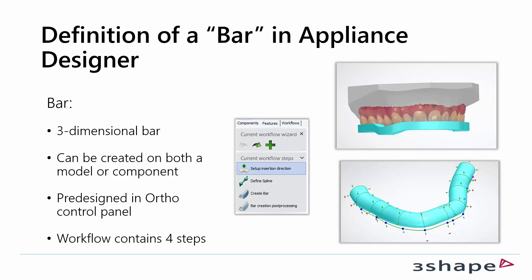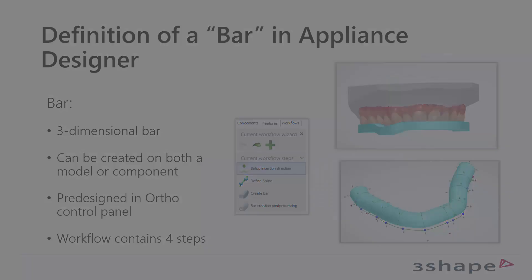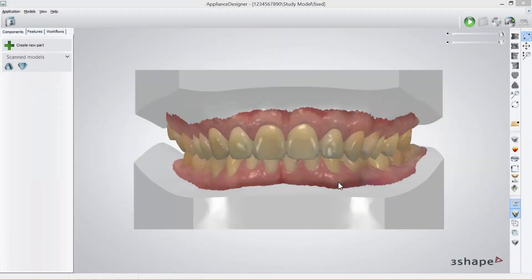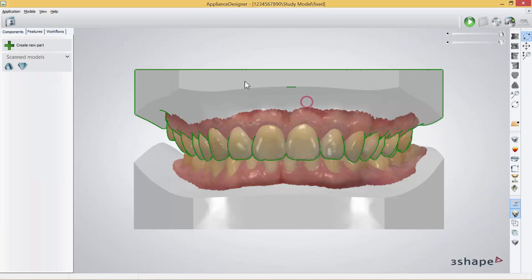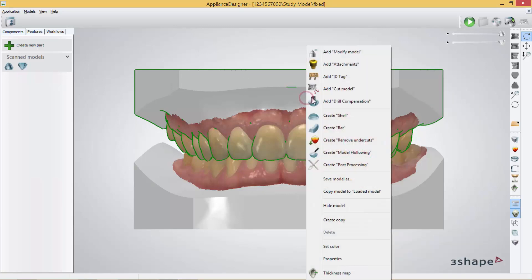To create a bar the workflow contains four steps. Once in Appliance Designer, you will click on the part you wish to build on. It will have a green outline. I will now right click and then press Create Bar.